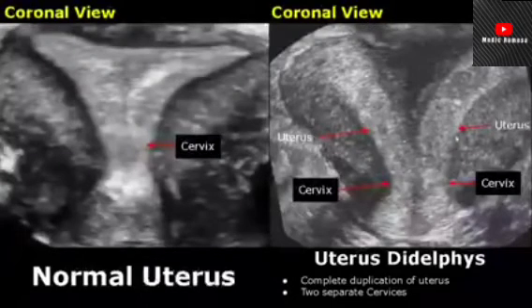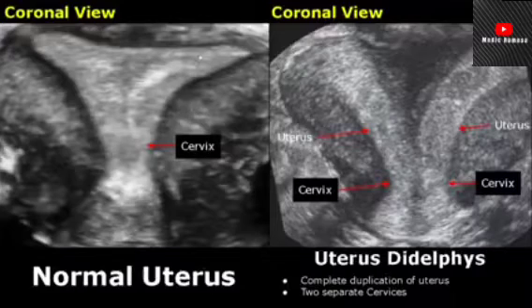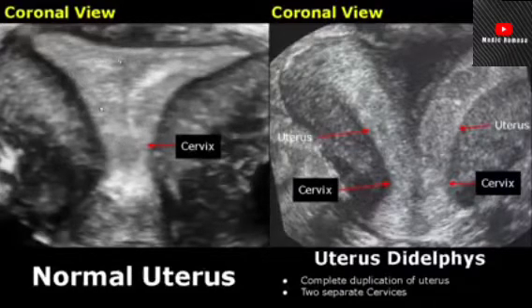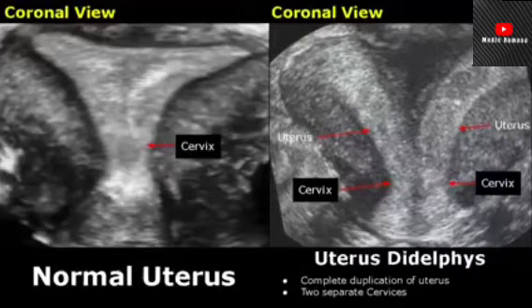These are 3D reconstructed coronal images of the uterus. This view is best for diagnosing congenital uterine malformations. This is how a normal uterus looks in a coronal 3D ultrasound image, and here we have two separate uteri showing complete duplication of the uterus and cervix.